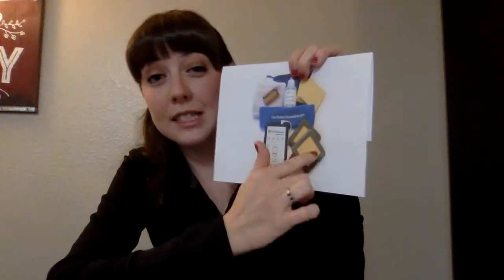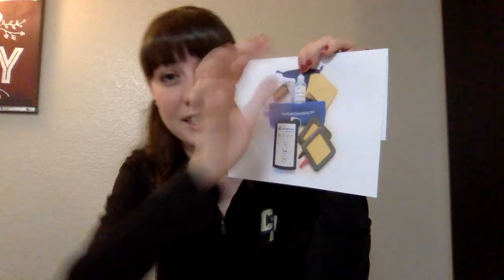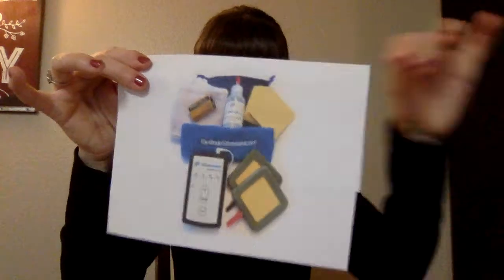You then want to prepare these sponges, and you want to generously soak them in saline solution. And then these are all the replacements, so you soak those in saline solution as well. And then on your client, if it's on the forehead, even with a client like me with bangs, the electrode could go through to my skin.